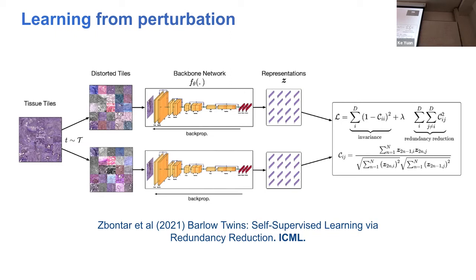They will manifest themselves in the cross correlation between representations. The meaningful information in the image will repeat itself to a certain degree, and you'll be able to get it from here. That's Barlow Twins. I find it a very, very intuitive model to understand.